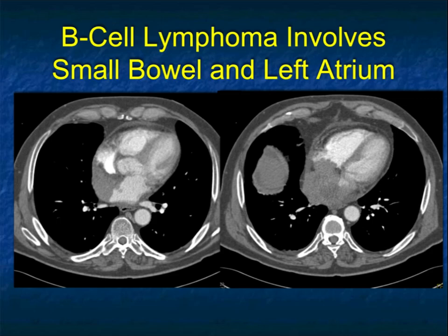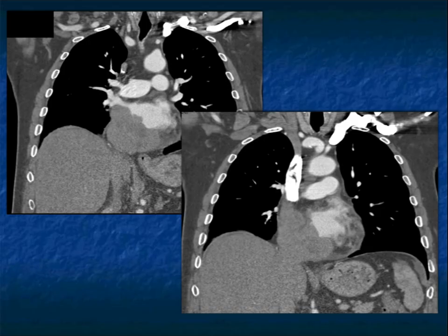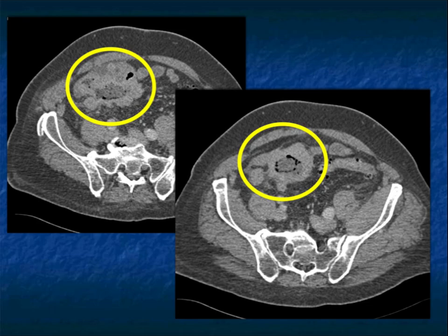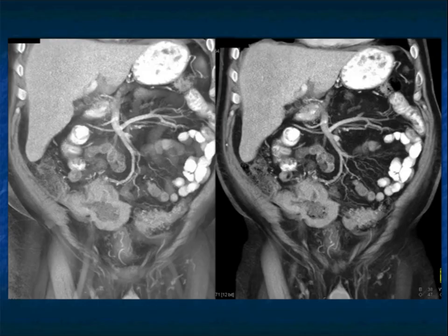This is a patient with B-cell lymphoma who presented with chest pain. There's a mass involving and encasing the left atrium, raising the question of angiosarcoma, lymphoma, or metastasis. When the patient's abdomen was scanned, a large ulcerating mass was found in the right lower quadrant. This is a good example of lymphoma involving both the small bowel and the heart. Lymphomas, as in this case, can be ulcerating.